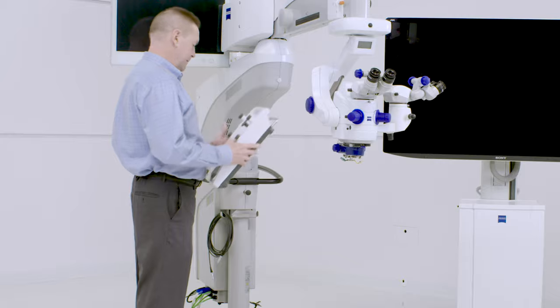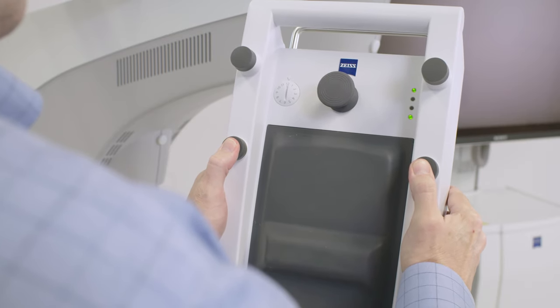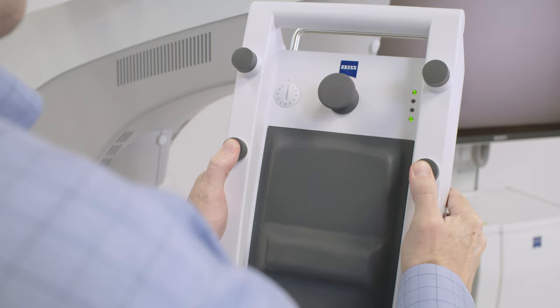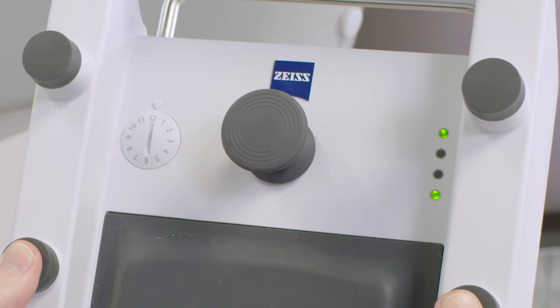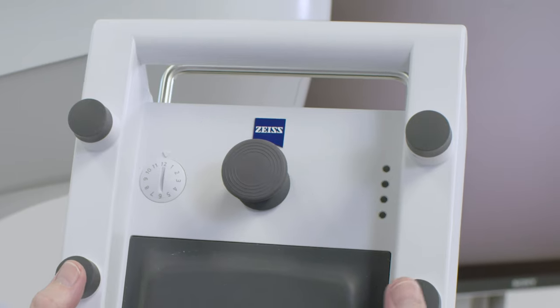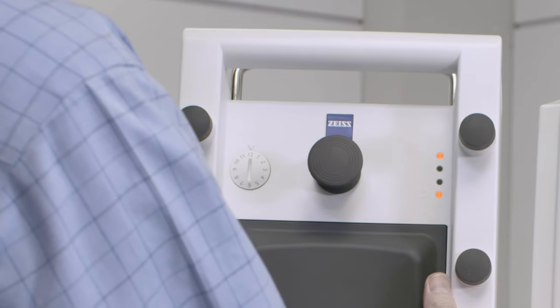Next, check the LED light on the foot control panel for good battery strength. Simultaneously press a button on the right and left side of the foot control panel. A solid green light at the display indicates strong batteries, a flashing amber light indicates weak batteries, and a flashing red light indicates bad batteries.